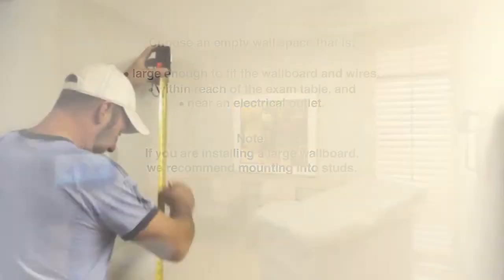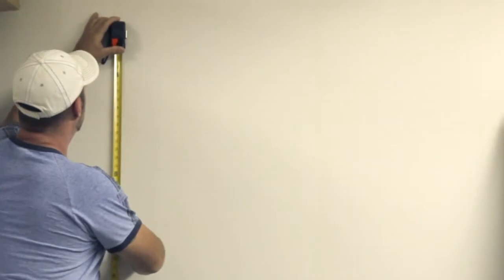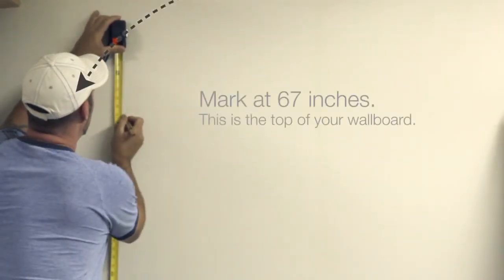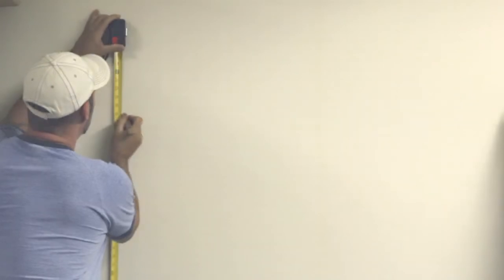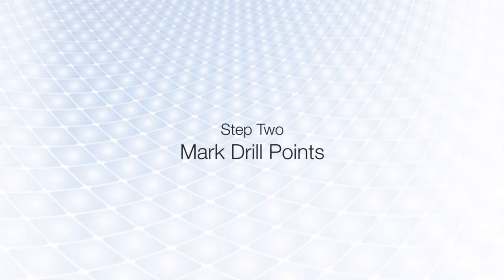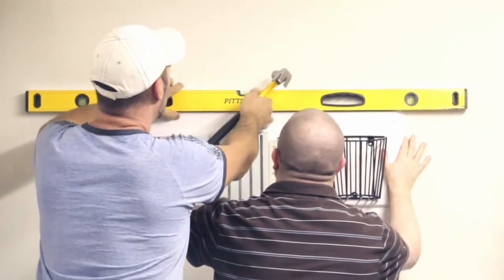Using your measuring tape, measure up from the ground to a height of 67 inches. This is the recommended height of the top of your wall board. Hold the wall board so the top lines up with the pencil mark.